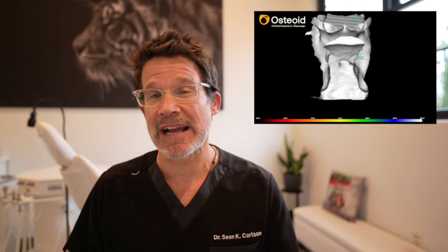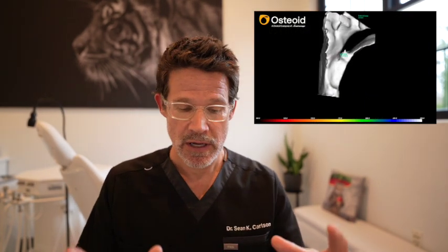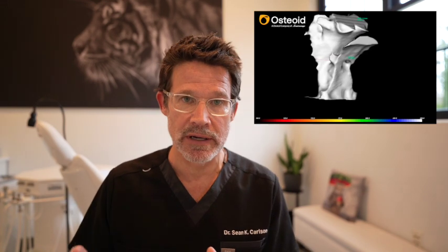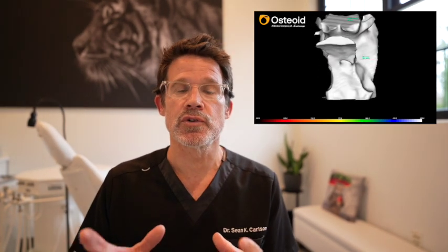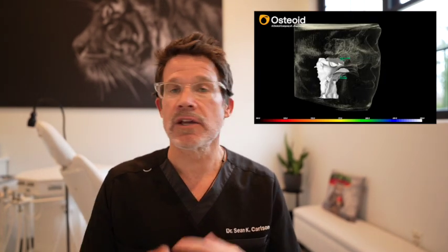And for impacted canines, for example, what we often do is we simulate the movement of the canine so that the surgeons can actually understand what our traction vector is going to be for those impacted teeth, and they can remove any bone in the area in the direction of that traction.